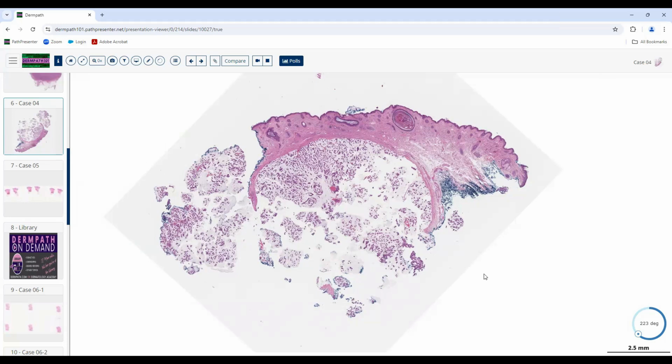Kind of the big features associated with this particular lesion have to do with the deeper dermis, or that entrapment of what's going on in there. So something's going on here, isn't it? That's not normal. Yes, that's correct. This is pretty normal over here. Yeah, it seems like normal up here. We've got this thing going on down here.